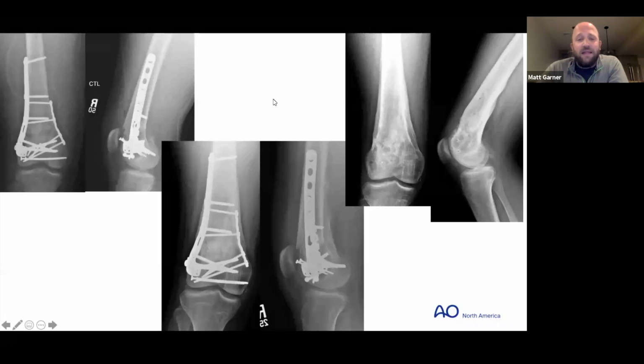He also had that little spur on his distal femur that you can see in those central images. I'm not entirely sure if that was translation or where that articular impaction fragment was with the front to back screw. So I burred that down too while I was there. I think it was causing a little bit of symptomatic patellar clunk. So it was a combination of reasons I took it out. I usually do not. Gotcha.